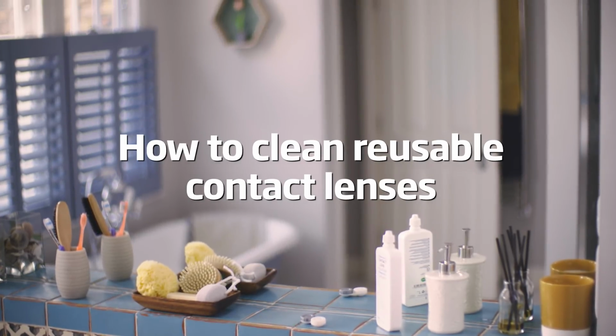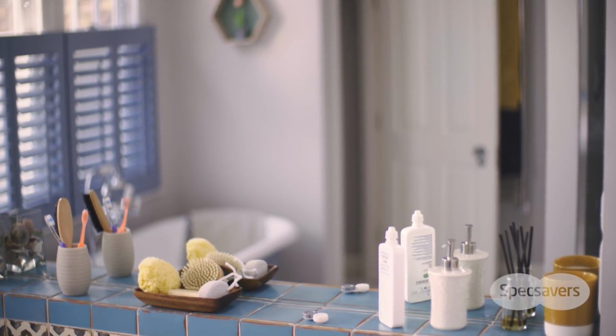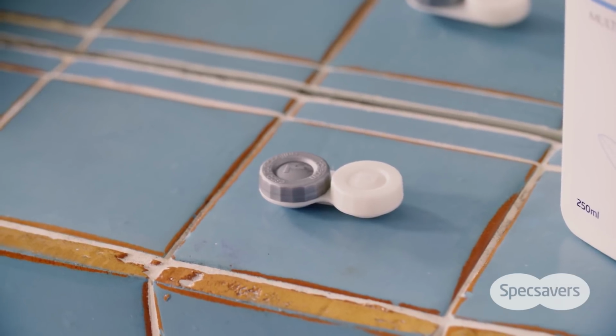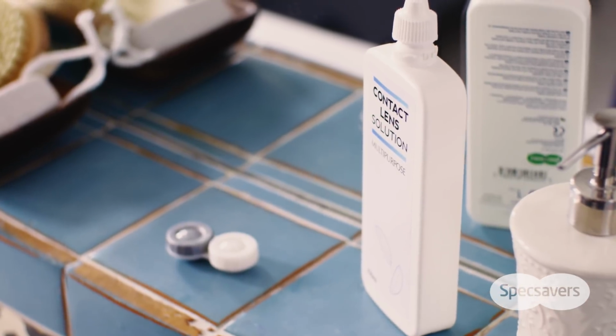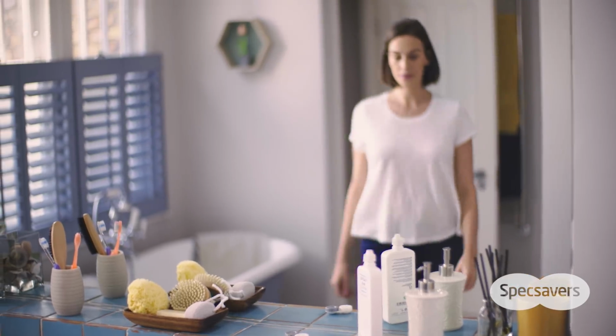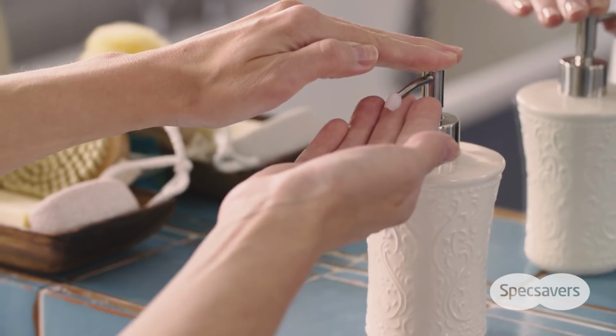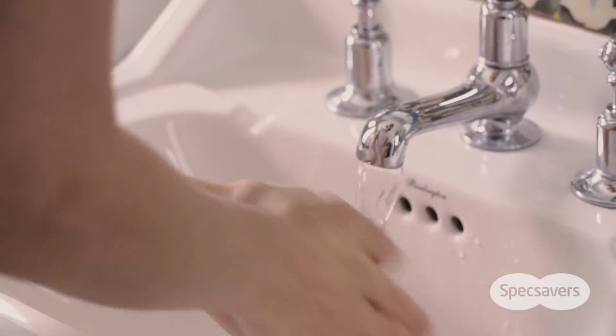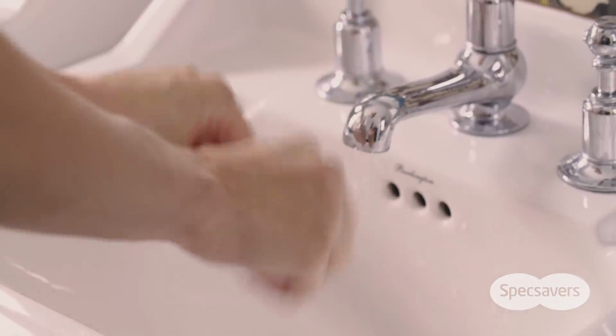How to clean reusable contact lenses. Keeping your reusable contacts clean is really important. The first rule for cleaning your contact lenses is never rinse your lenses or lens case with tap water. Tap water can contain certain organisms that may cause infection, but water is great for washing your hands. Before you handle your lenses, always make sure your hands are clean and dry.